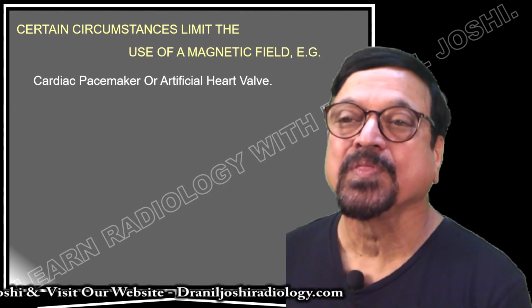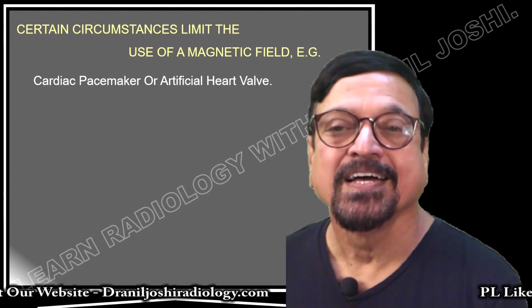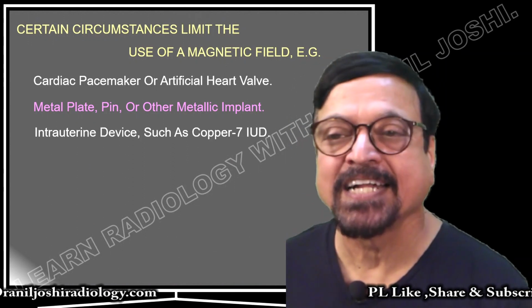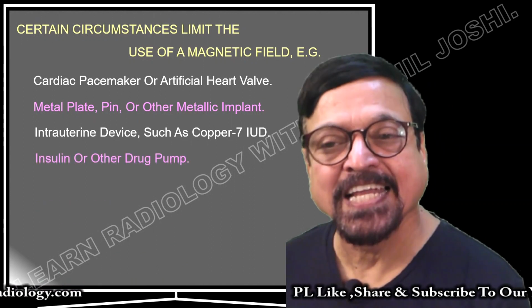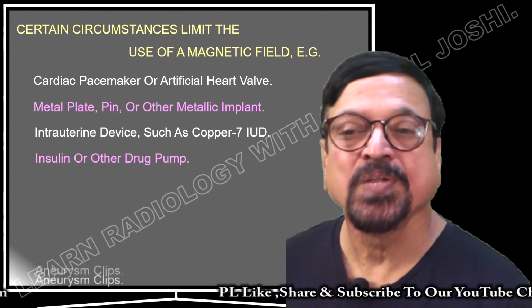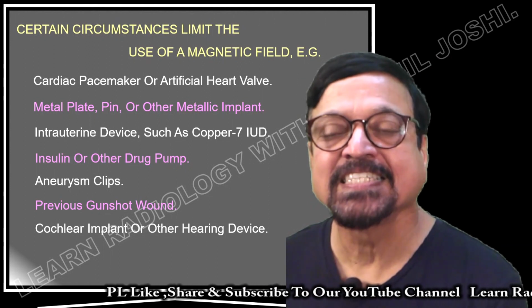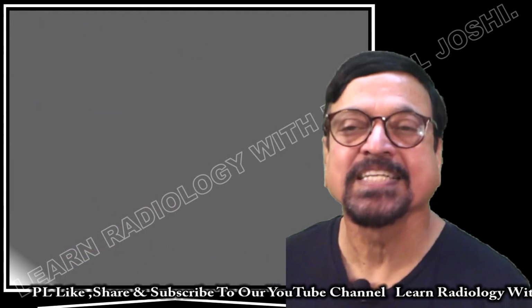Now when you do not use MRI, it is the same contraindication as in the earlier MRI lectures. Cardiac pacemaker, artificial valves, metal plates, pins, implants, then intrauterine devices. Sometimes even a dental filling can also disturb. It can cause artifacts. Now insulin pumps, then aneurysmal clips, gunshot injury, then cochlear implant, all these things are extensively covered because they are common to all MRI tests and MRI lectures. So this is the same as all.